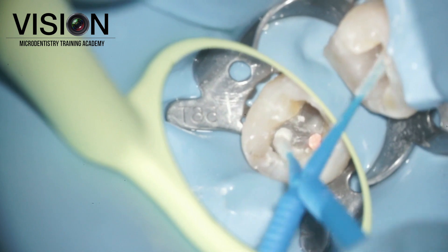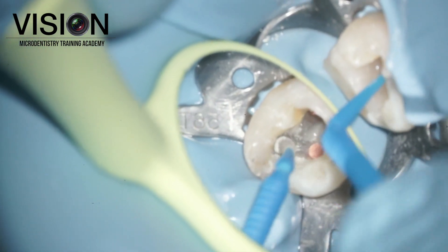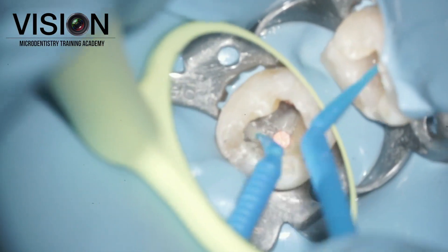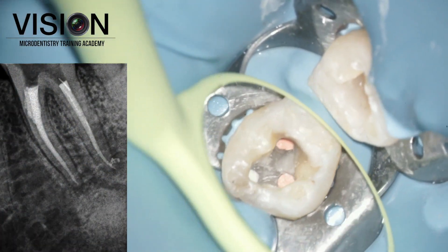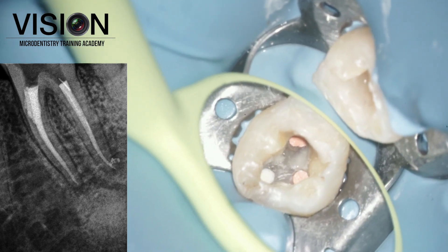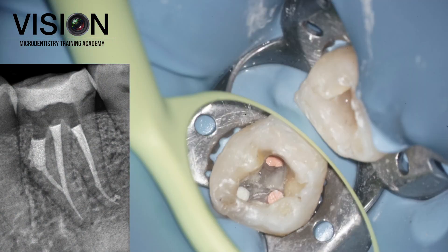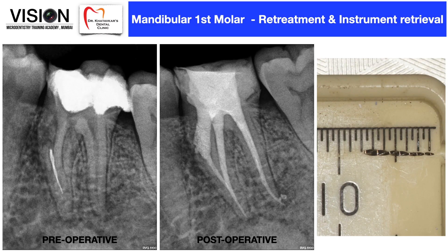The micro brush helped us clean everything. That was followed by placing a small piece of wet cotton pellet and a temporary cement. That's how we sent the patient back after retrieving the instrument, doing the obturation, and sealing the perforation — all in one appointment. The patient was recalled after 24 hours and we completed the post-endodontic restoration. This was the final radiograph showing the obturation in both canals and the MTA used to seal the perforation.